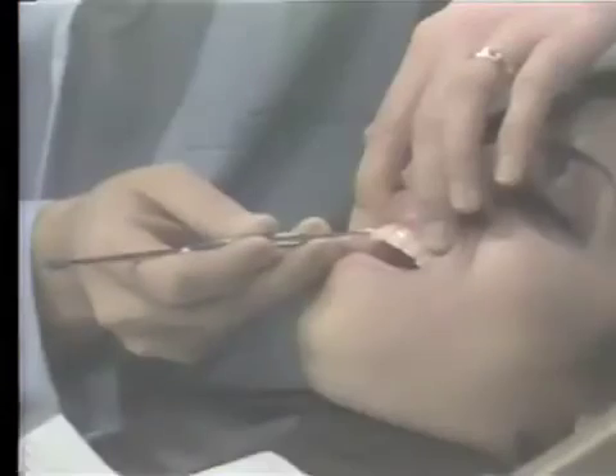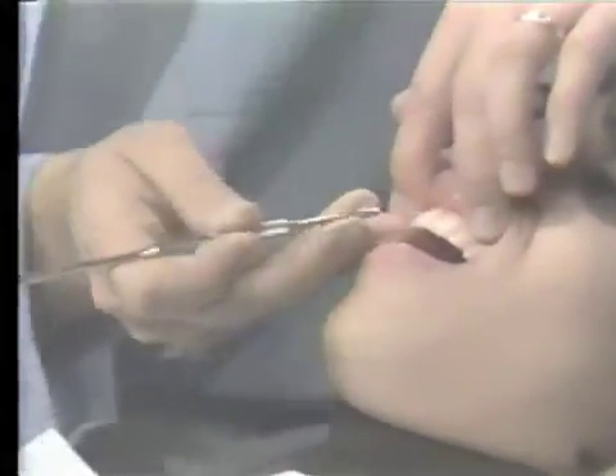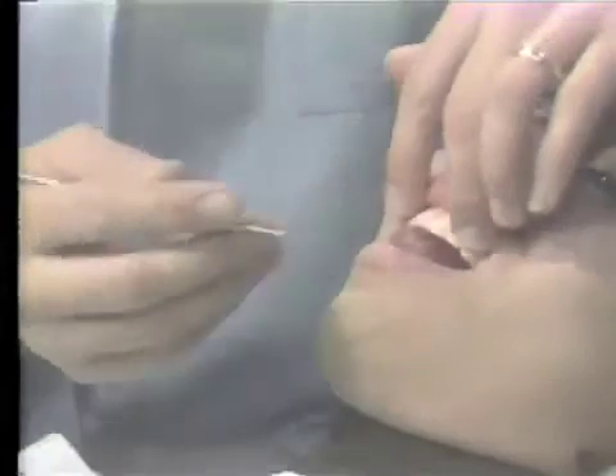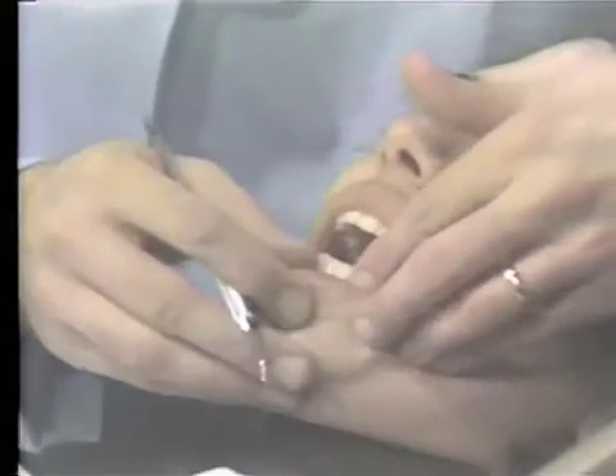In many areas of the mouth, the fulcrum finger is moved to the occlusal or incisal edge of the teeth. And in some places, you will find that it is more convenient to place the fulcrum finger on the labial or buccal tissues.